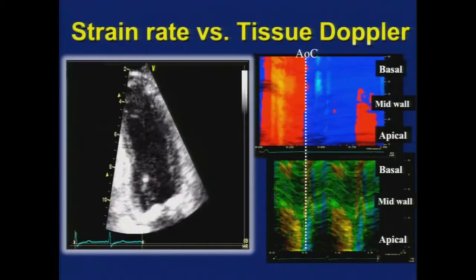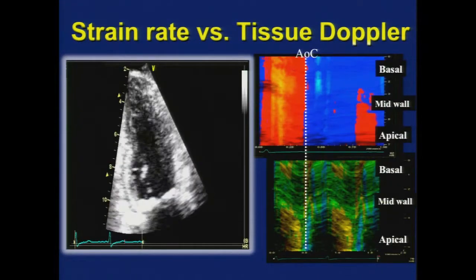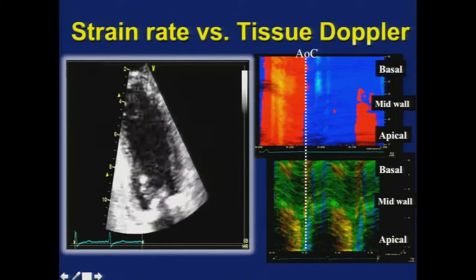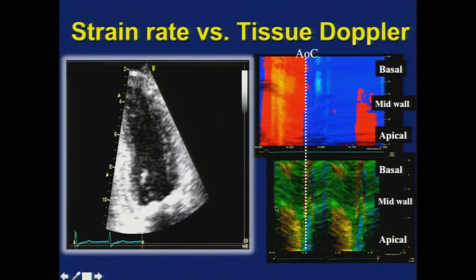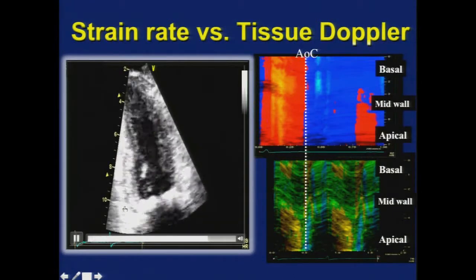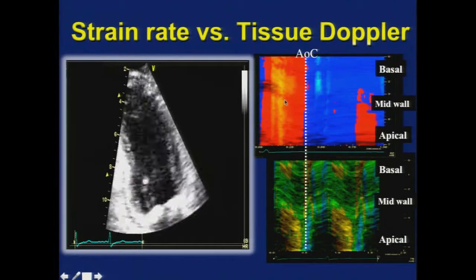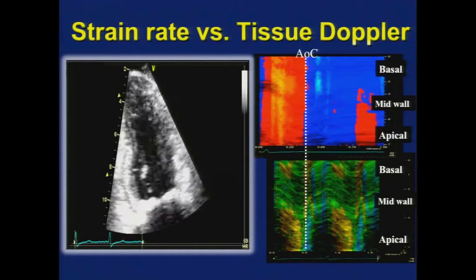So now when we go back to this apical two-chamber view, the image that we had been working on over the last few moments, on the bottom is this parametric display of strain rate. And the way you interpret this is that anything yellowy orange represents compression or contraction. Anything blue is elongation, and green means nothing is happening. So that basal inferior wall really is akinetic, there is a wall motion abnormality. It was not depicted or identified in color Doppler because of this concept of tethering, because the mid and apical segments are contracting well, and it's pulling that segment along with it.